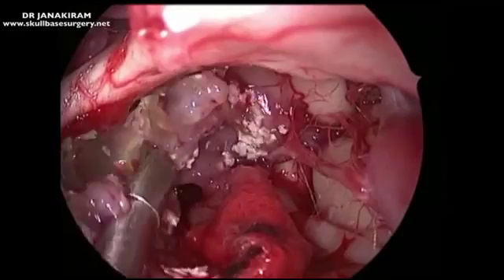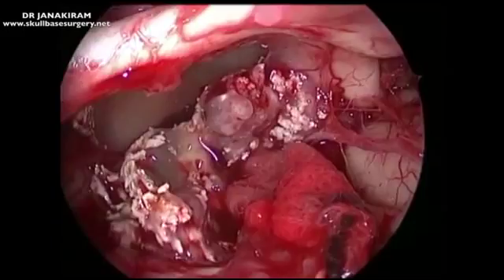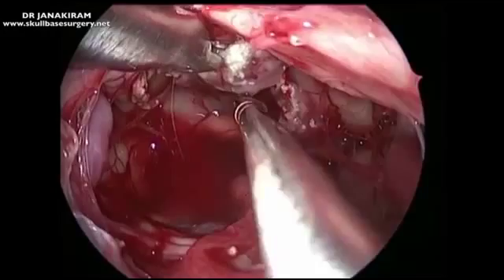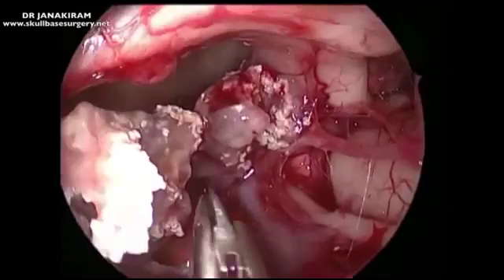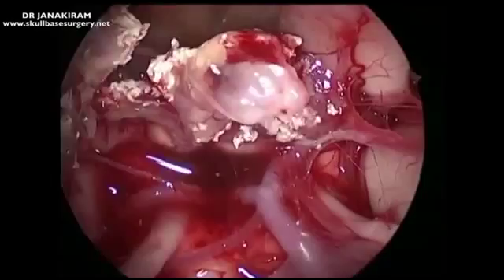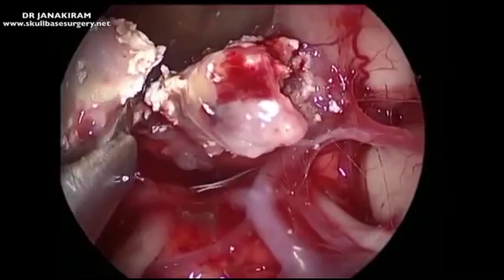You can see the last remaining adhesions of the tumor. That is the last bit of the tumor we decided to remove. This surgery is all about patience — patience of the surgeon.